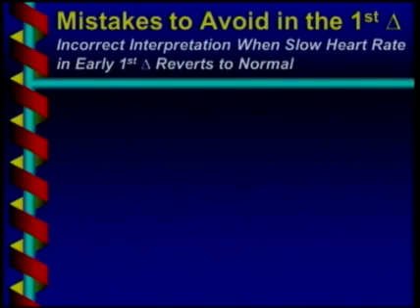But what if the heart rate is slow on a scan today? We recommend a follow-up in 10 days, let's say a week or two later, she comes back and the heart rate's normal. Does that mean that the risk is gone?